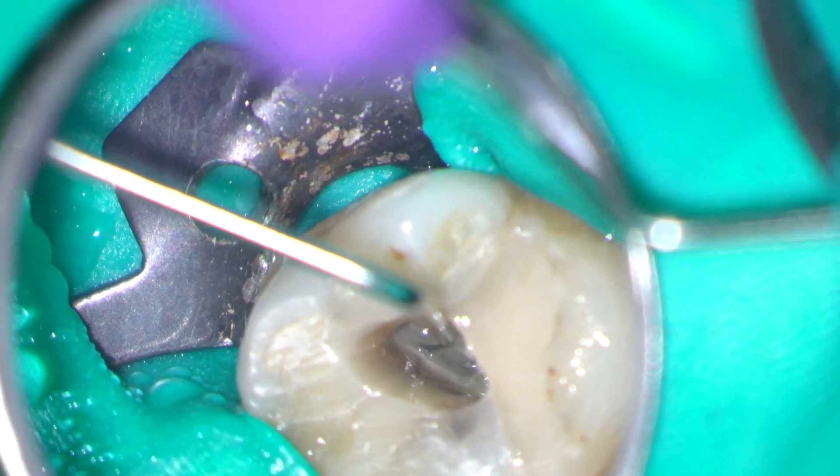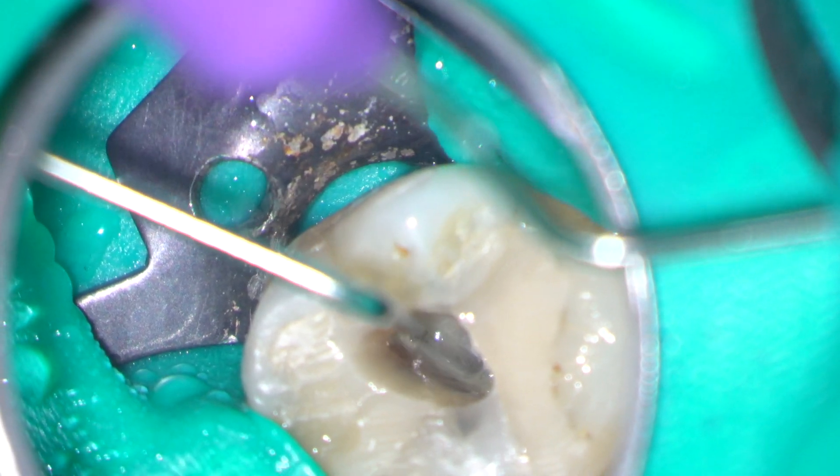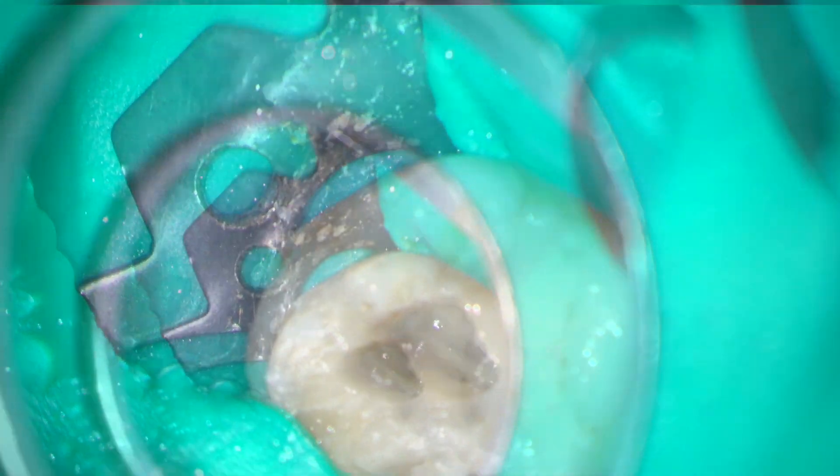Having located the orifice of the MB2, I can now flare this using the Wave 1 Gold Small Instrument.